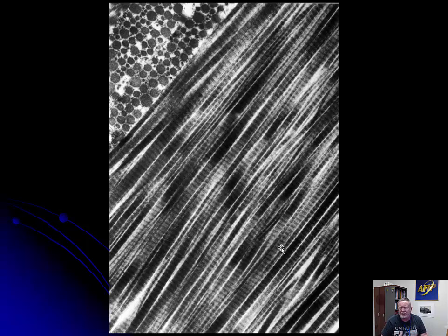Collagen is polymerized in the extracellular space. You have 3 strands which go together to make one mature strand of collagen. You can't see these in the cytoplasm of fibroblasts. They look like any normal cell. It's only when they're in the extracellular space that it polymerizes and forms true collagen. But I think collagen helps you to establish that you are deep in a tissue, maybe in mesenchymal tissue or something like that. So it's certainly worth looking at.